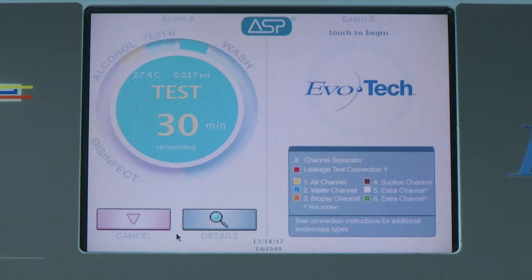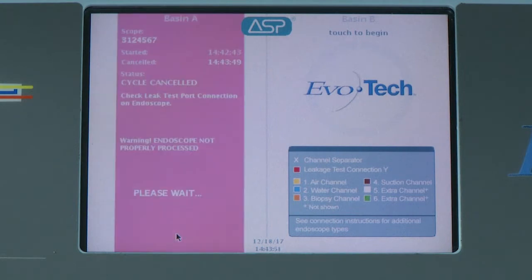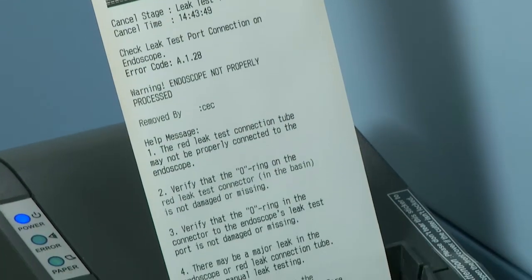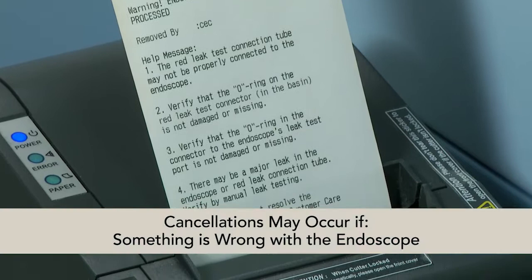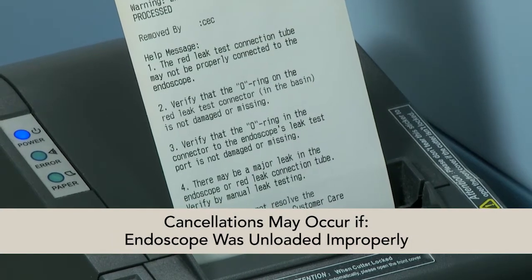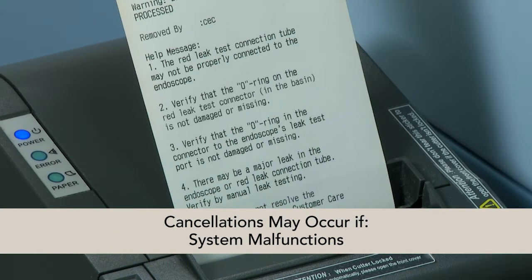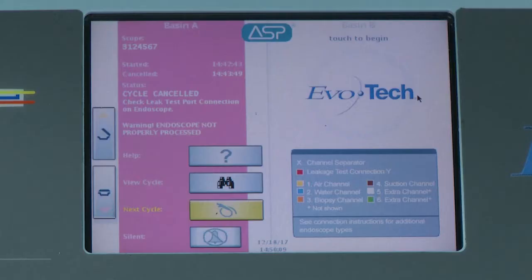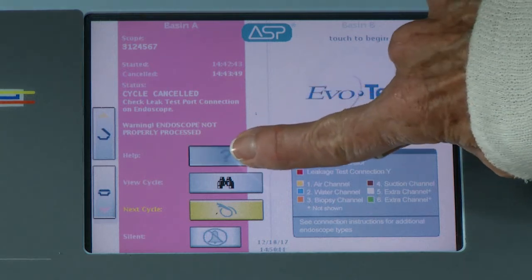If the cycle cancels, the touch screen will be red and an alarm will sound. The reason for the cancellation will be displayed on the printout. Cancellations may occur if there is something wrong with the endoscope, the way it was loaded, or if the system has malfunctioned. The message will direct you to which action to take if a cycle cancels. You may also touch the Help button for more information.